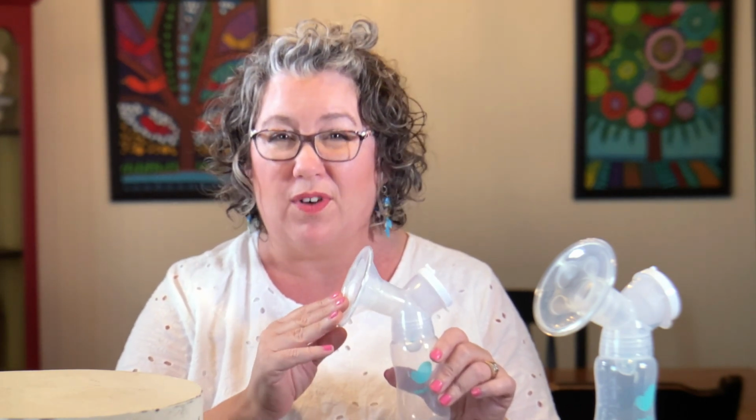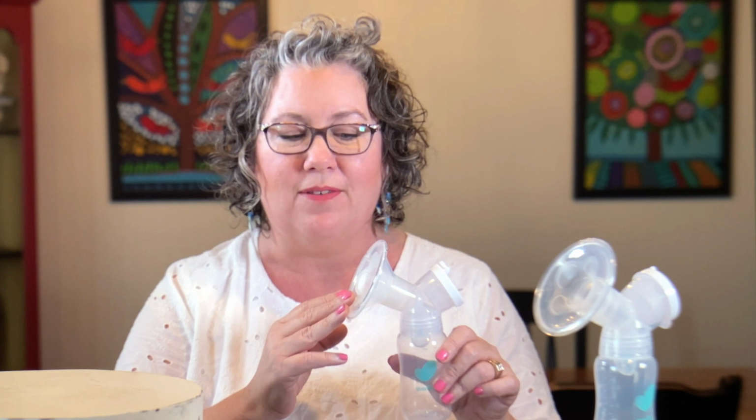Your collection bottles come already assembled, which is kind of nice because it gives you an idea of what it's going to look like when you put it back together when you're ready to pump. But before you pump, you need to take everything apart and sanitize it before first use. So let's do that together.